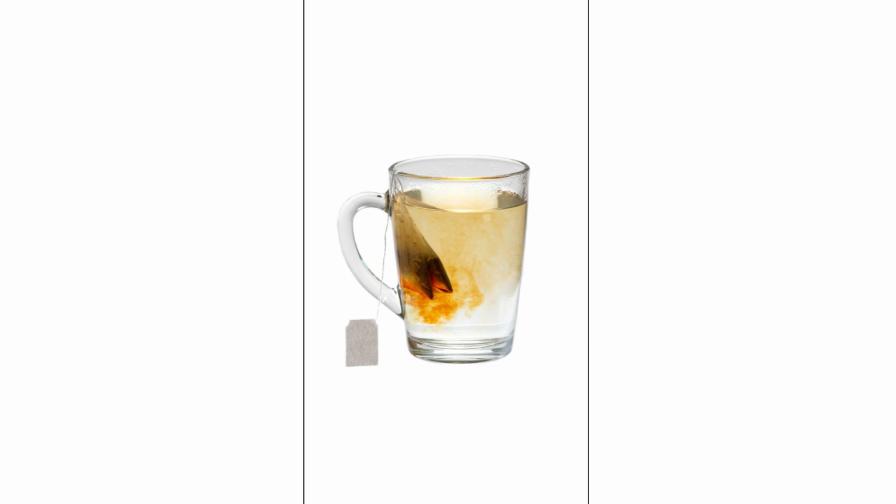And if you look closely, you'll notice something. The small tea molecules travel far, forming a light brown cloud, while the larger tea molecules stay closer to the bag. This simple everyday scene exactly is diffusion. And most part of our dialysis works the same way.